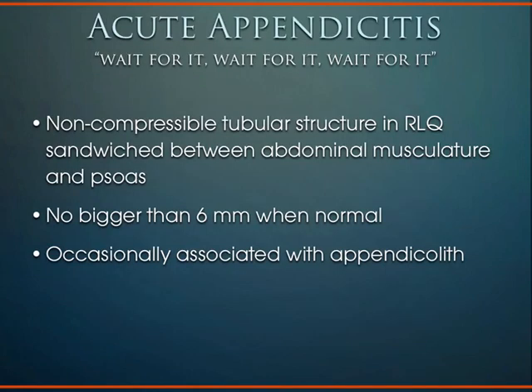And finally, appendicitis, one of the most challenging things you can do with an ultrasound probe, in my opinion, but also one of the most rewarding and important things that you can do with an ultrasound probe. The trick here is to just be really good with ultrasound and develop these skills over time and practice. The other trick is to time the administration of narcotic analgesia to the patient.